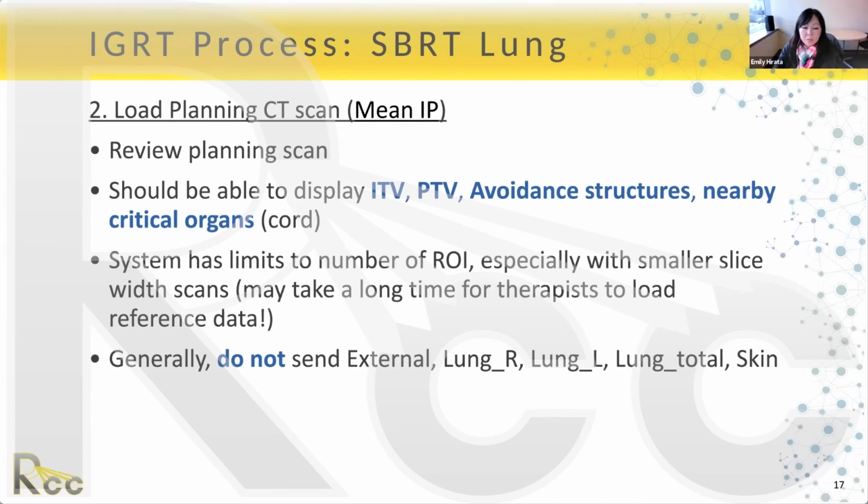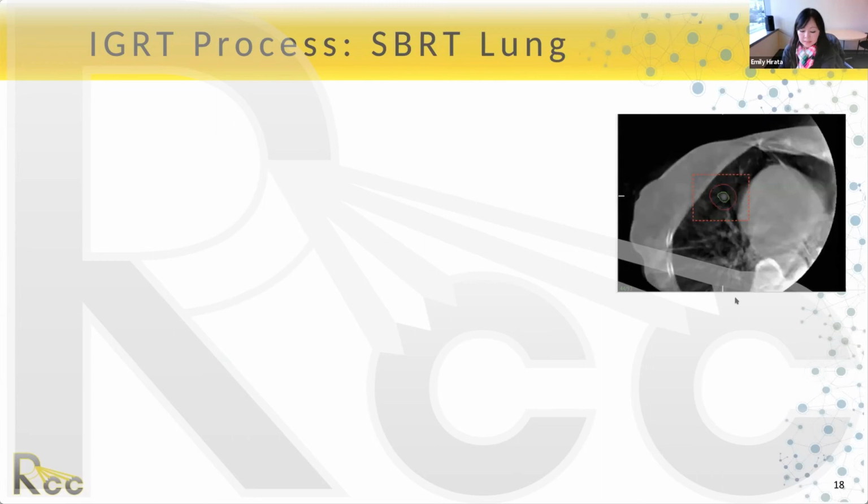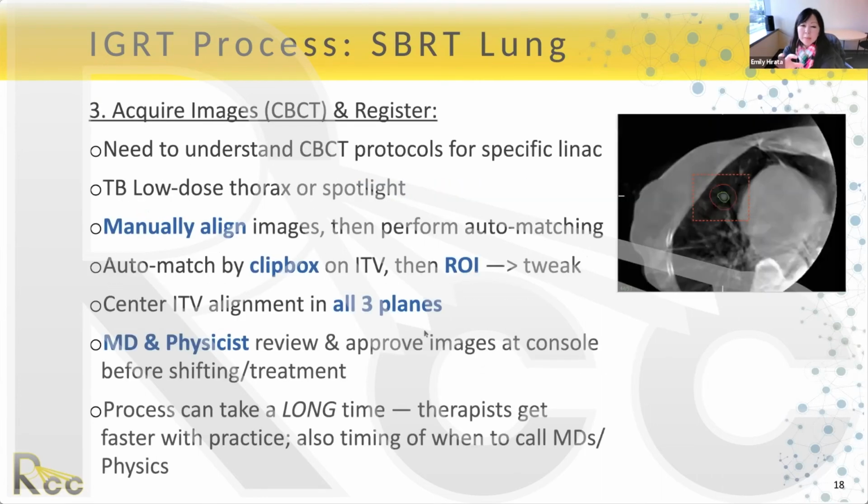Okay, that's another reason why it's important to have your physicist and physician there. That's also why it's important to turn on your critical organs, because it is not uncommon for the therapist to only look at the ITV and PTV when they're looking at the registration and not looking anywhere else. So I think your question is actually a very good question. It's a very important point.